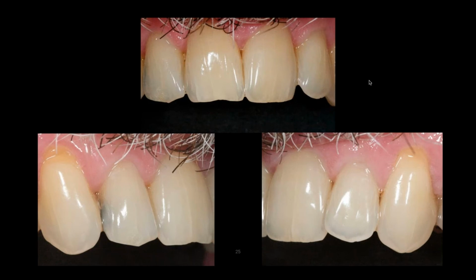They're absolutely stunning if you have the right tooth structure behind it. And you can fire these VITA blocks with VM9 or Lumex on it, and you're not going to warp them or anything because the melting temperature is super high. And that's what my go-to material is when I have a decent tooth structure. I always fall back on my VITA blocks, and I can mill them and cut them down, set stain them, do whatever the heck I want, and they never move. And that's a beautiful thing.